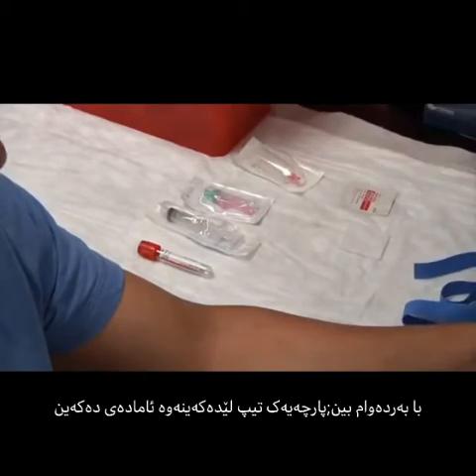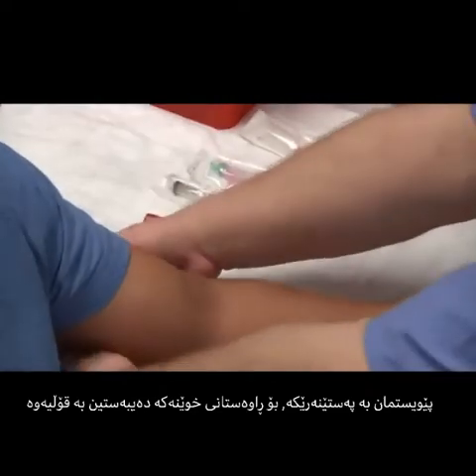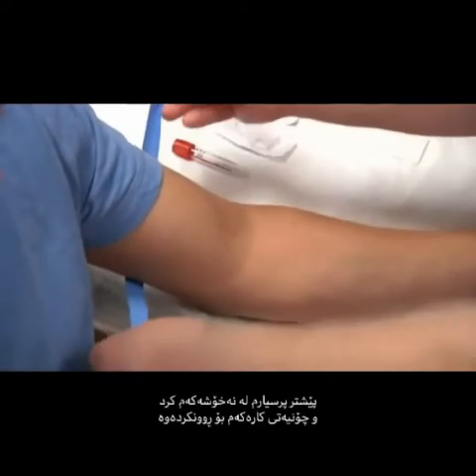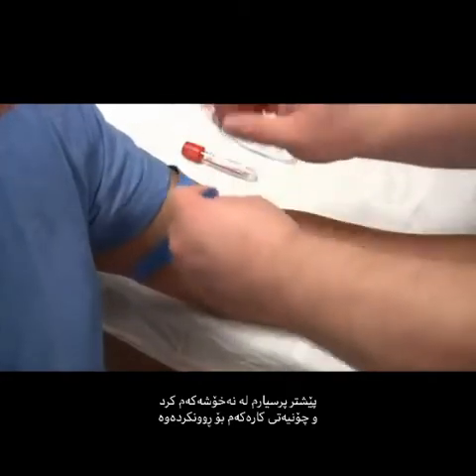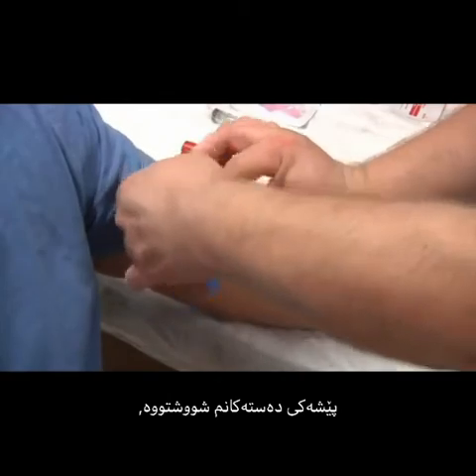Let's go ahead and tear off a piece of tape and put that on the corner of the table. We'll need our tourniquet — go ahead and apply this now. I've already asked my patient for consent and also explained the procedure. I've previously washed my hands.